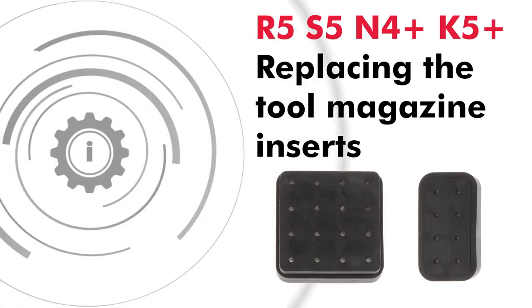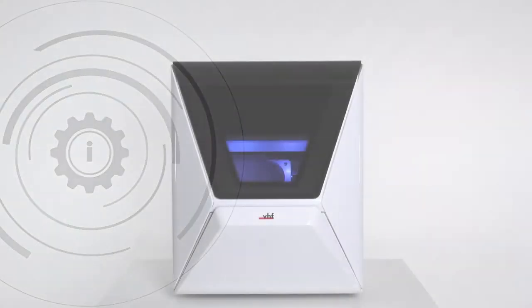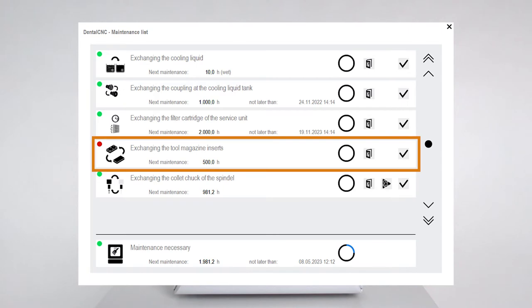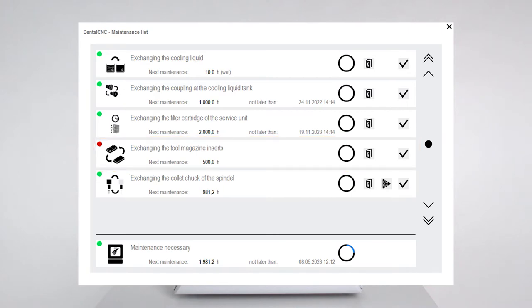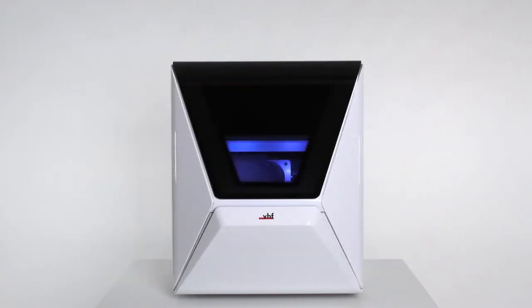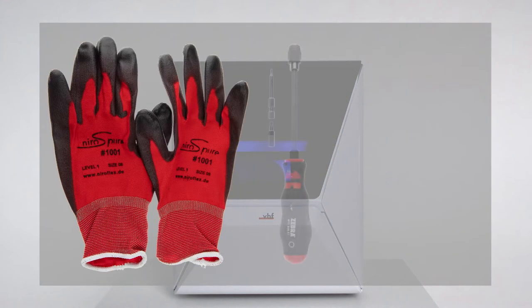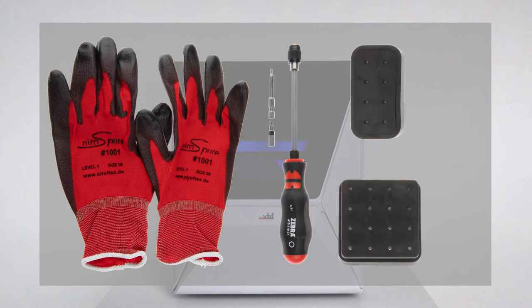In this video we will show you how to replace the tool magazine inserts. You will find this maintenance task listed as exchanging the tool magazine inserts in the maintenance section of Dental CNC. For this task, have the following items ready: protective gloves, a screwdriver with the appropriate bit, a spare tool magazine insert, and the dedicated drilling tool.